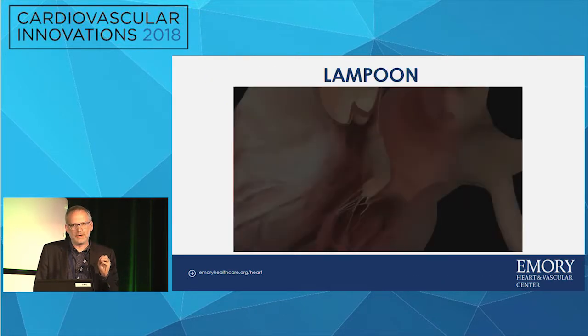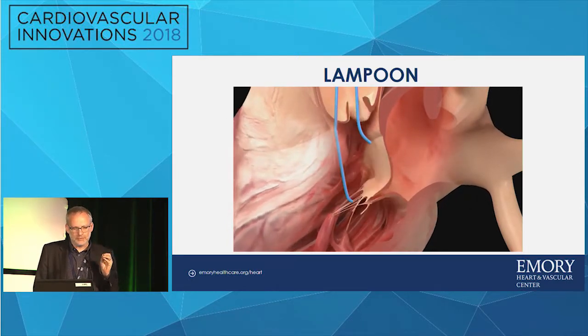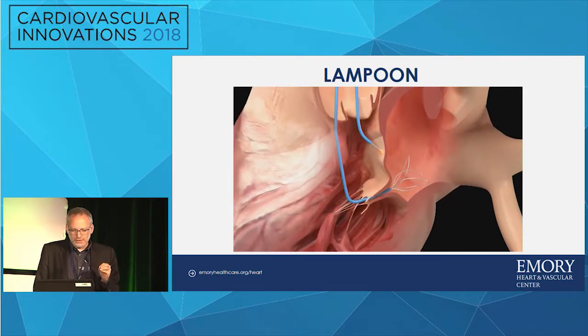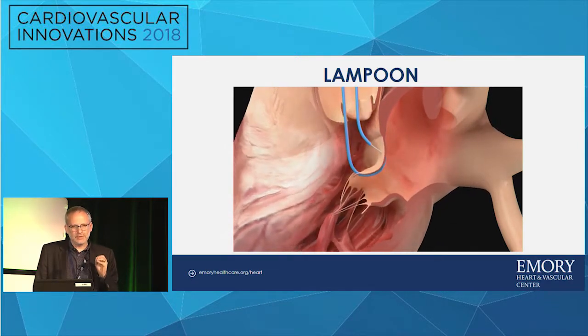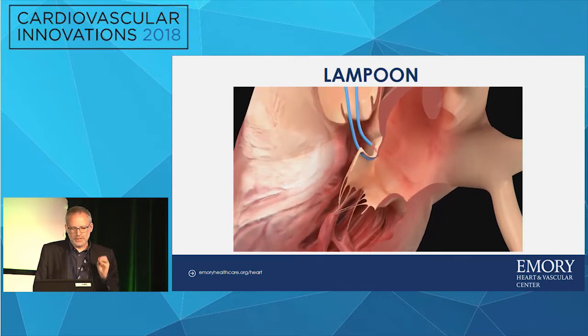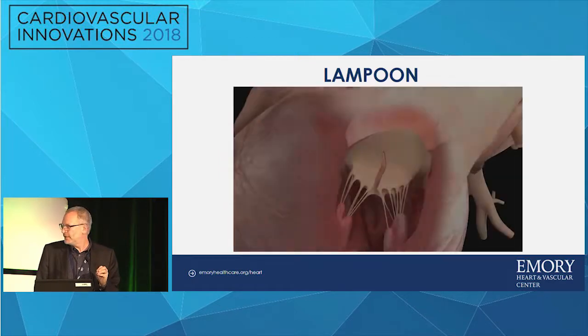So here's the Lampoon technique. What people don't understand is you need two retrograde catheters. You have to burn from under the leaflet through the base of the leaflet at A2, so you need to use transcatheter electrosurgery. All the snare does is grab it; it's not necessarily a target. The echo tells you where to go, but you do need to grab it to create the loop. This is the exact same thing that's done in Basilica. This is just the anterior leaflet of the mitral valve. First you electrify the tip, now you have to electrify the side of the wire, because you're going to slice from base to leaflet. Is everybody clear on that?